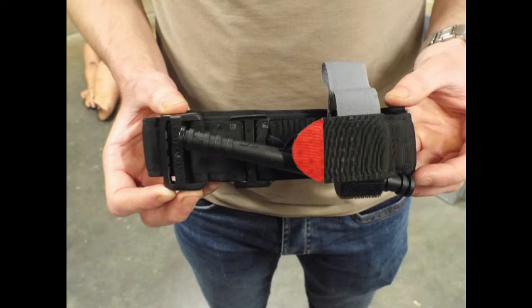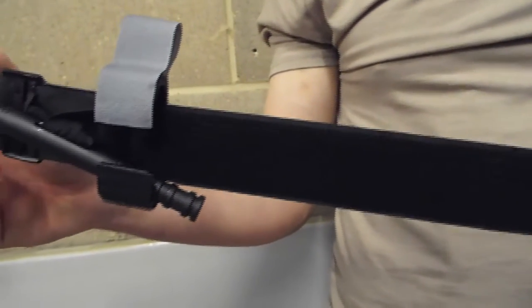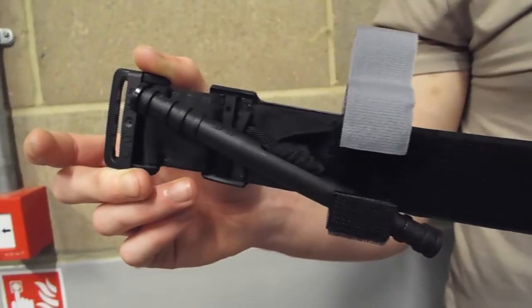The combat application tourniquet, or CAT, is an extremely simple and effective piece of equipment that can be used on limbs to stop massive arterial bleeding. Never apply the tourniquet to anything other than a limb, i.e. around a casualty's neck or head.